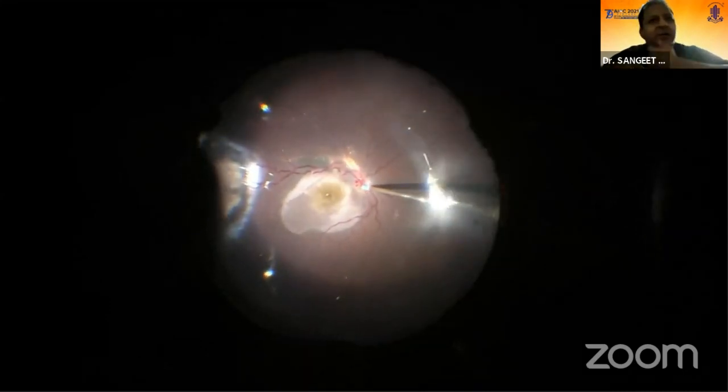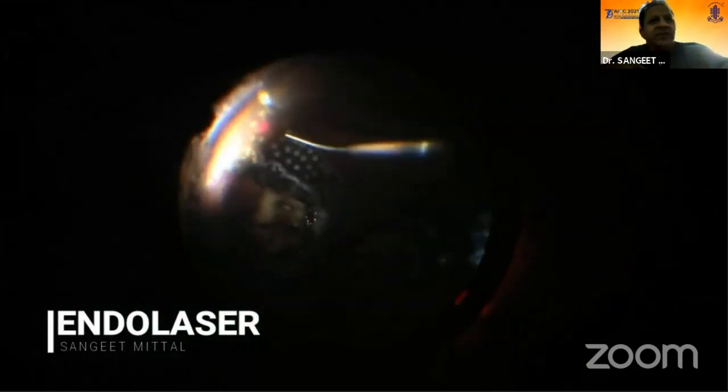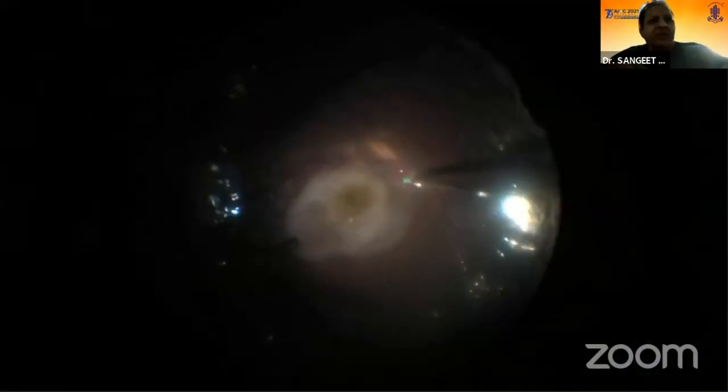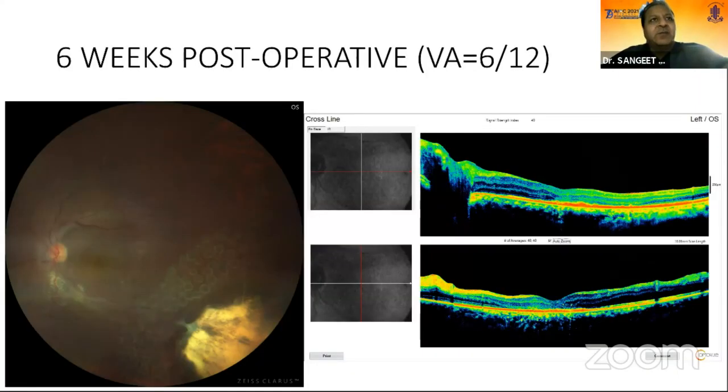We did a fluid-air exchange. You just have to take care in these large excisions of choroid. You don't use excessive air pressure. It has to be very soft, or you can do a PFCL silicone oil exchange. Otherwise, you can have serious complications like venous embolism due to air going into the veins. And this is 6 weeks post-operative, where the patient's vision had improved to 6/12.